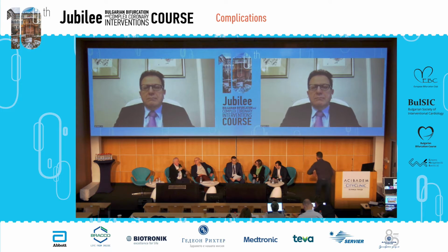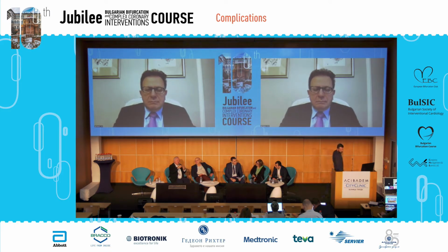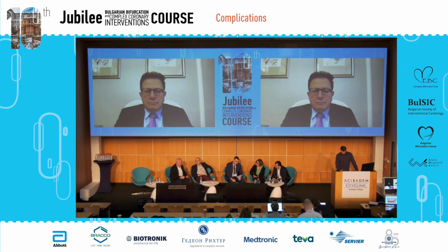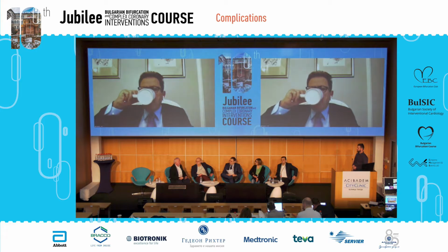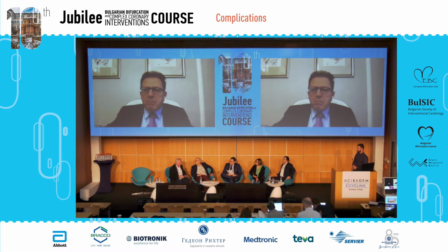Just a very short comment about the problem generated by the guiding and the dissection. The dissection was created by an injection without pressure. Hydraulic. And in our group, what we say is you have a doctor taking care of coronary arteries, and not a second doctor looking at the pressure. He won't do that. He's only looking at the pictures. So we have a nurse to look at the pressure, and she is pushing the button of the machine to inject. And if you say, okay, test, and she says no, this is no.